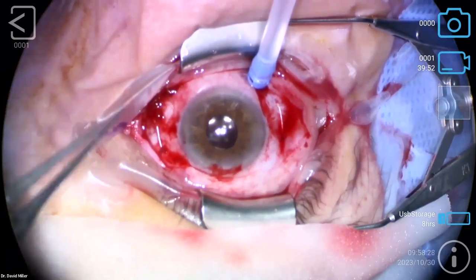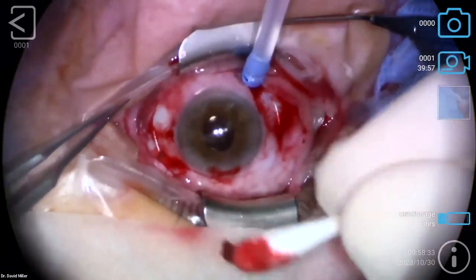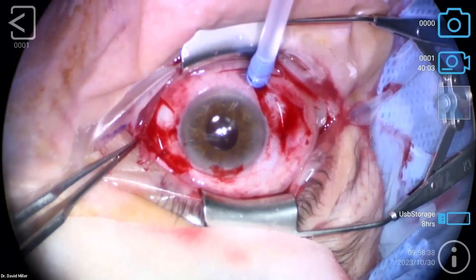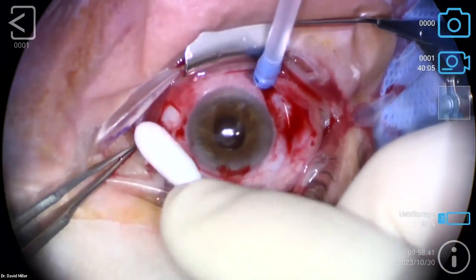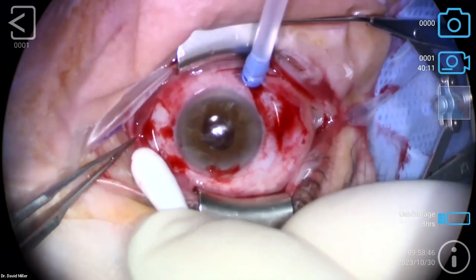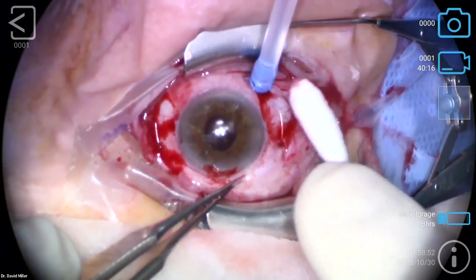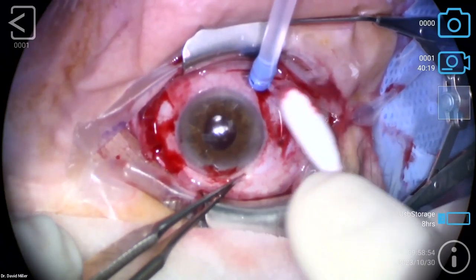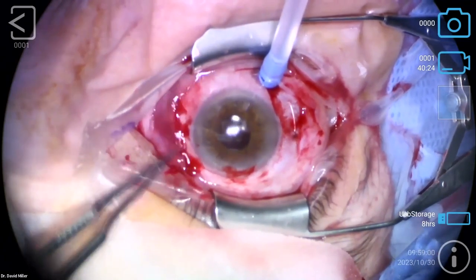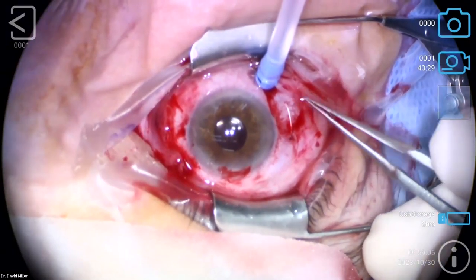Let's see here. Got a Q-tip. And the bleeding stopped nicely, by the way, so we're just going to wipe this blood out so the field's a little cleaner. Got another Q-tip there. There we go. We're going to check the wounds here. That one's dry down there, a little bit of blood coming up, but that's just from the wound, but no fluid. Over here, also dry, very good. You got some BSS for the cornea? We'll put the conjunctiva up. We're going to put the corneal wound suture in, and we're all set.